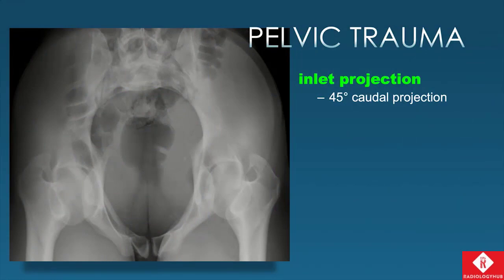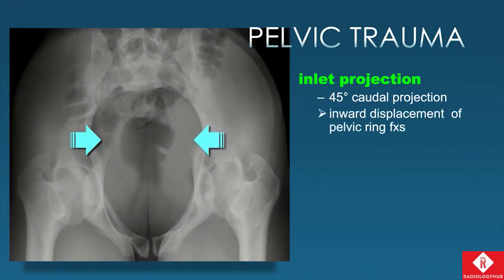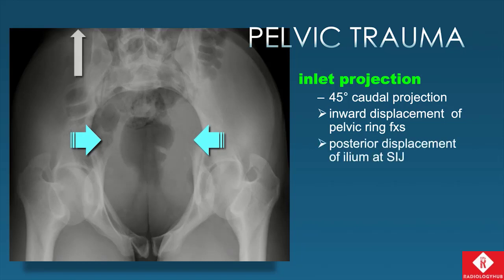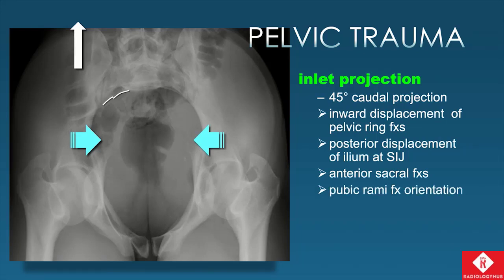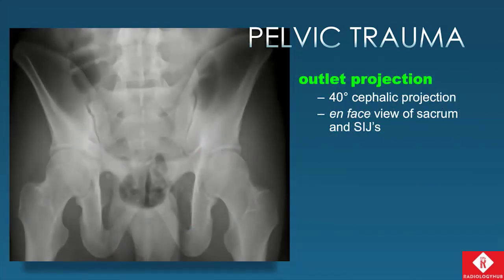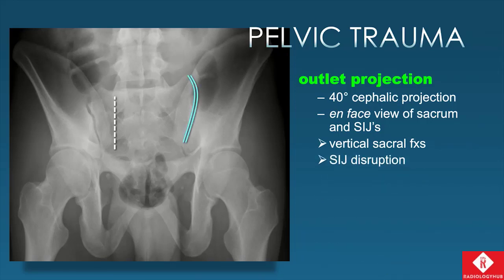The inlet projection is done at around a 45-degree caudal projection. You can see inward or medial displacement of pelvic ring fractures, posterior displacement of the iliac bone relative to the sacrum at the SI joint, and crush fractures and buckling of the anterior sacral wall. We can also see the orientation of pubic rami fractures to suggest whether these are anterior or lateral compression type injuries. The outlet view gives an en-face view of the sacrum and anterior SI joints, allowing us to look for vertical sacral fractures and vertical displacement of one hemipelvis relative to the other.